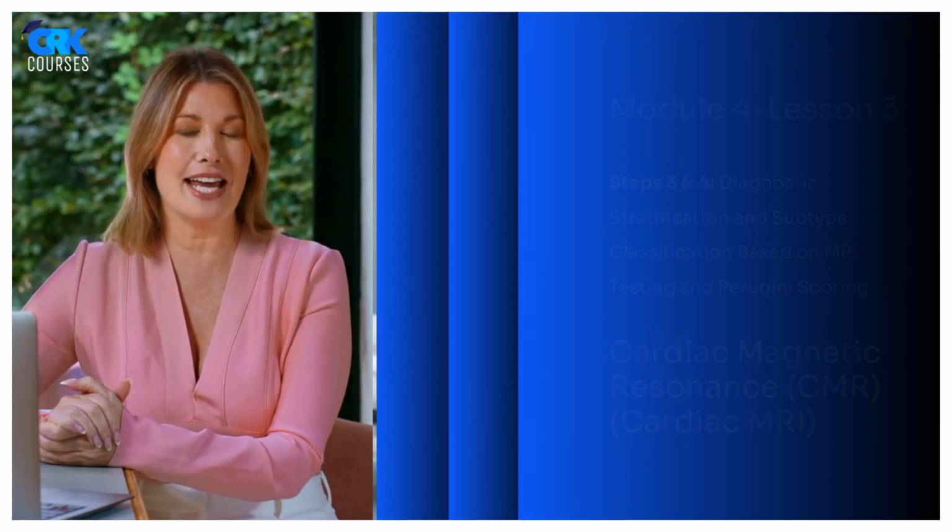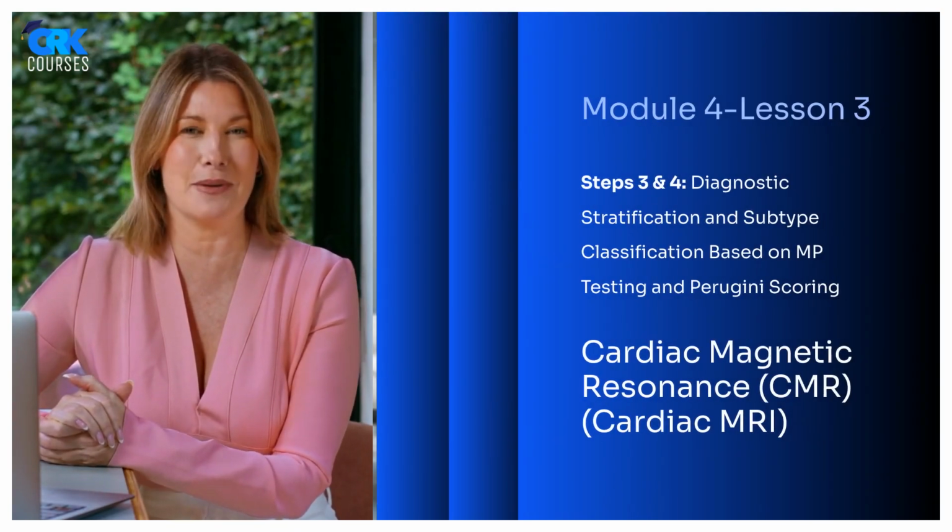Welcome to Lesson 3, Cardiac Magnetic Resonance, CMR, or Cardiac MRI.